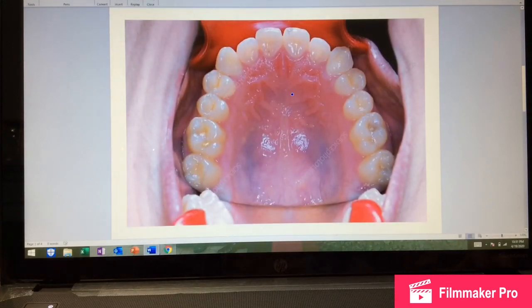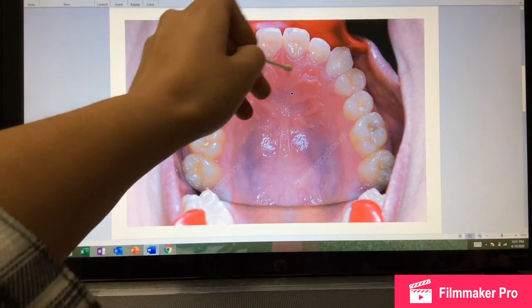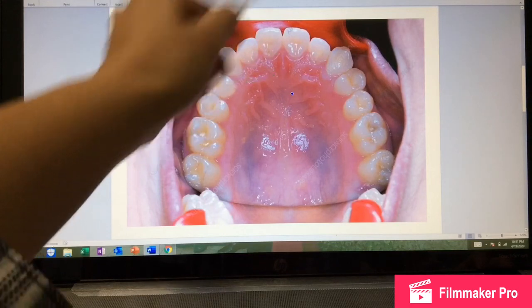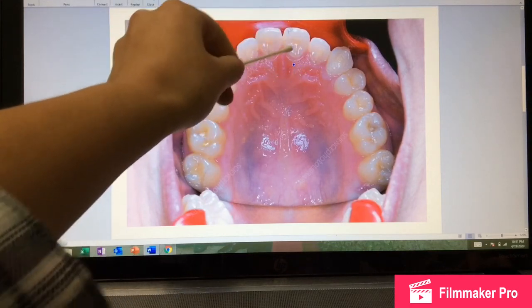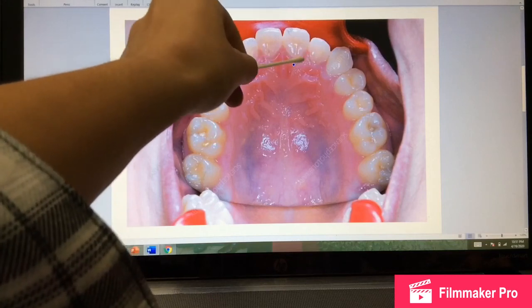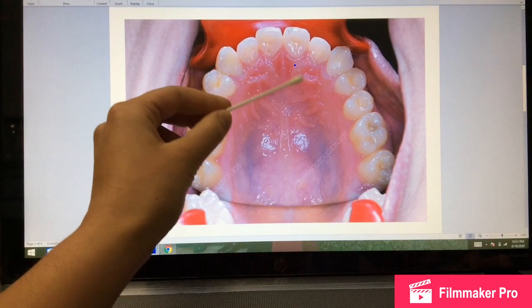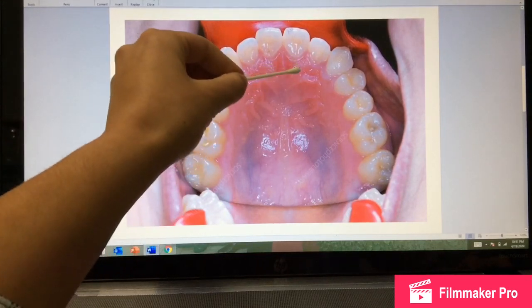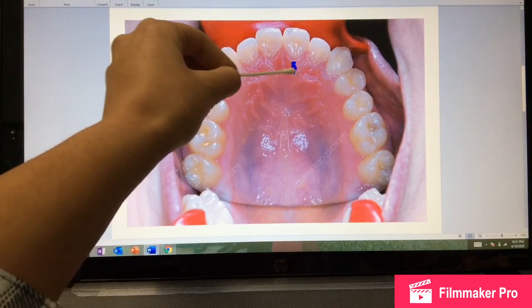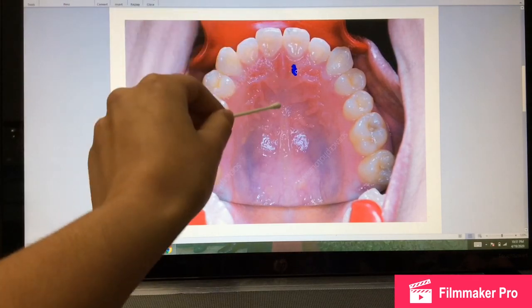After we do that, we need to do the nasopalatine injection as well. We don't want to inject directly on this; we want to do it beside that. We're going to do it on this side since we want to numb this tooth here. It is going to run a little past this way, but regardless, it's going to be at this side, right here in this area for the nasopalatine injection.